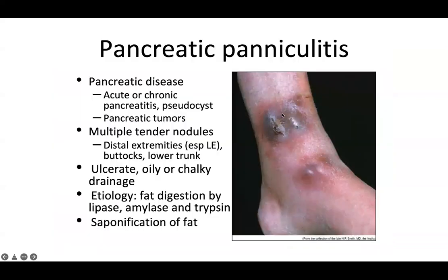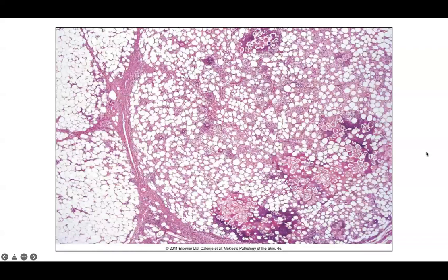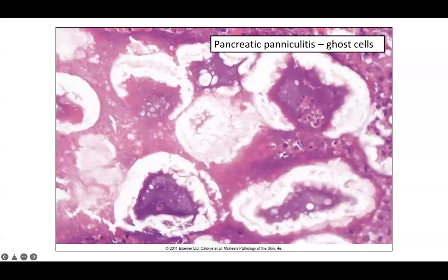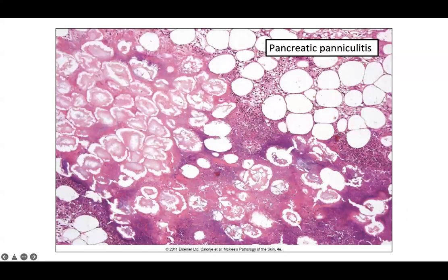These large cells are called ghost cells — large adipocytes filled with eosinophilic material with a rim of calcification and a deep purple basophilic stain. This is saponification due to leaked enzymes, giving you that draining oily material once it exudes through the skin. Importantly, if you see a pattern like this, make sure the patient doesn't have a concurrent infection, especially mucormycosis or Rhizopus, as pancreatic paniculitis can masquerade as a fungal infection in immunosuppressed patients.